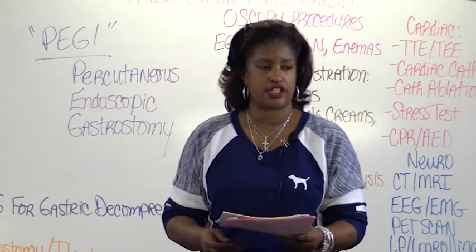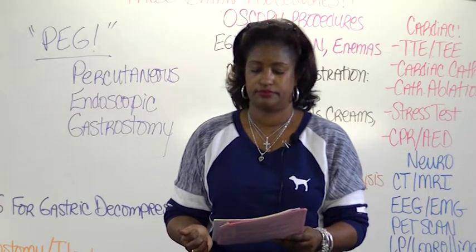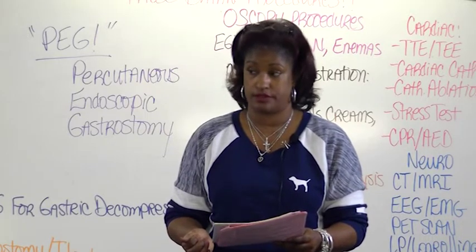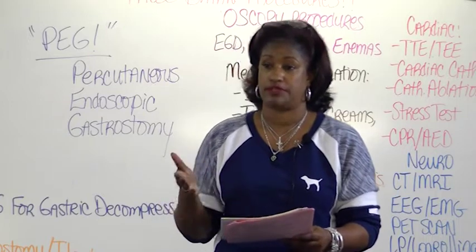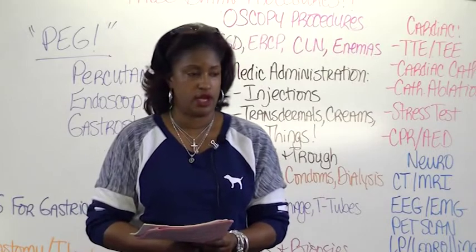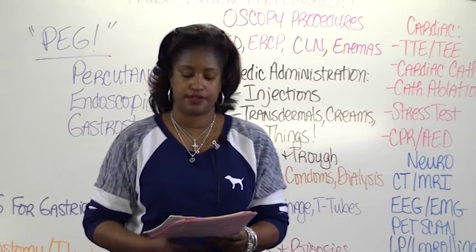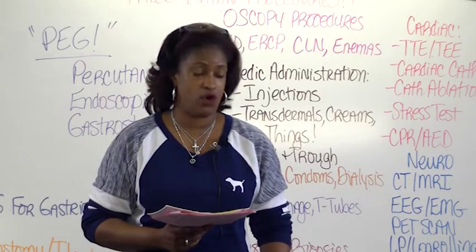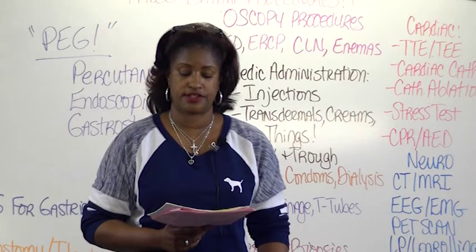You must flush before and after every bolus. And you need to flush every 3 to 4 hours in between continuous feedings. I'm going to say that again. You have to flush before and after every bolus and every 3 to 4 hours during a continuous feeding.